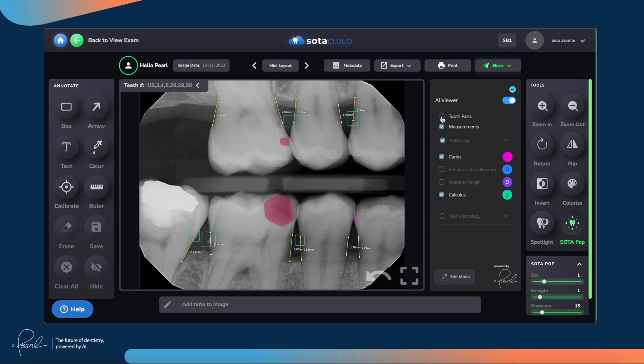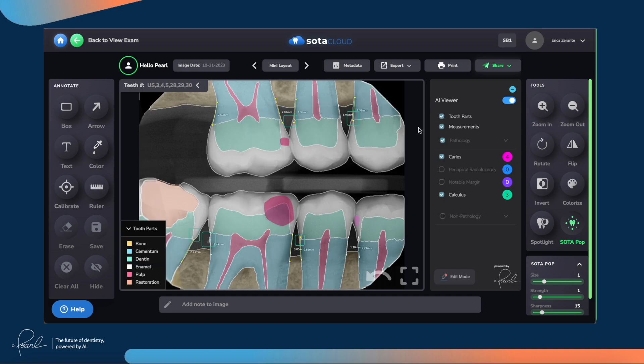One of my personal favorite features, and a feature that most dentists really appreciate, is the tooth part segmentation. These are tooth part maps that let you show the patient much more easily the different parts of their tooth, so you can give them a clearer sense of what is really going on in their mouth. You can say, 'See this cavity? This is almost touching the nerve here,' which is that pink forked area. It makes it so much easier for dentists to present to patients and really helps build the patient's understanding, which plays a big role in the increased case acceptance we see from dentists using this tool.